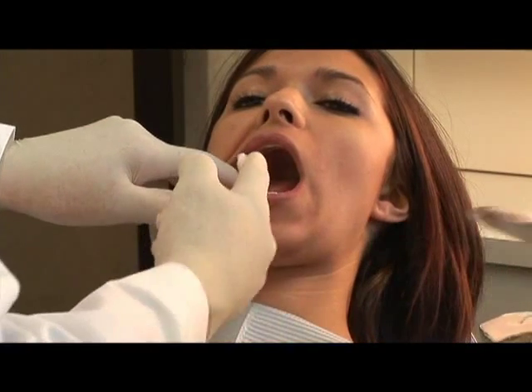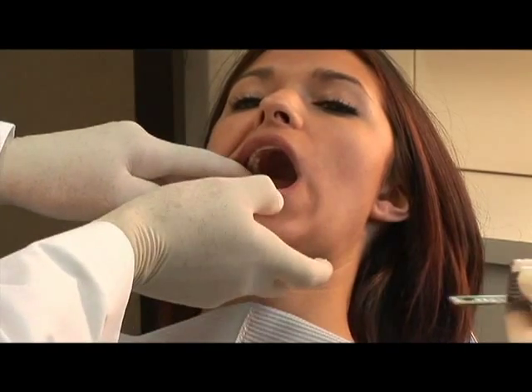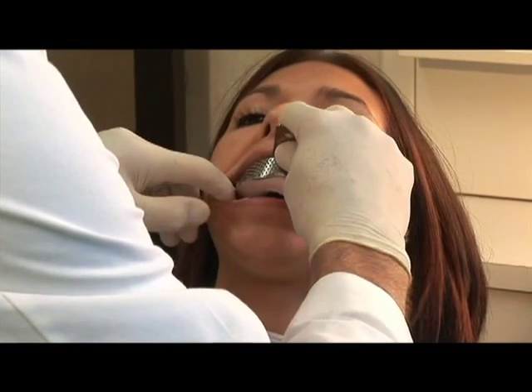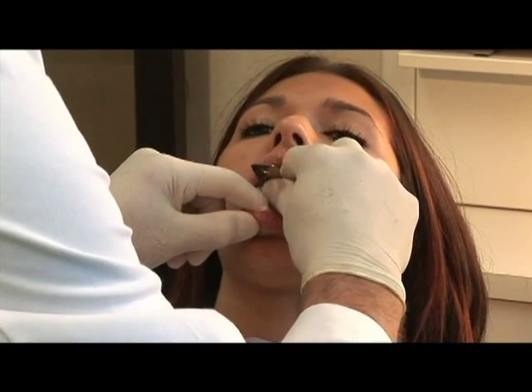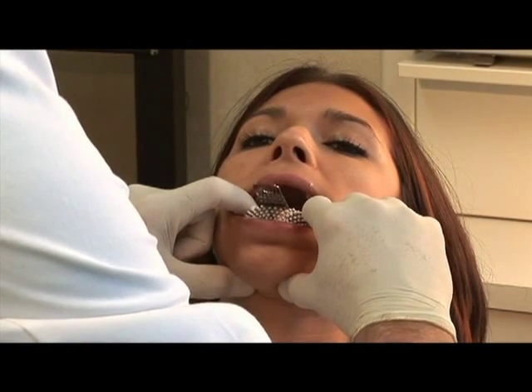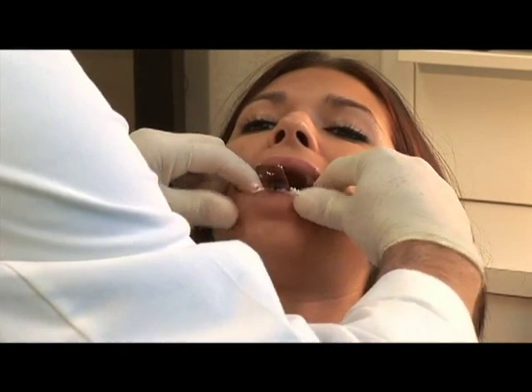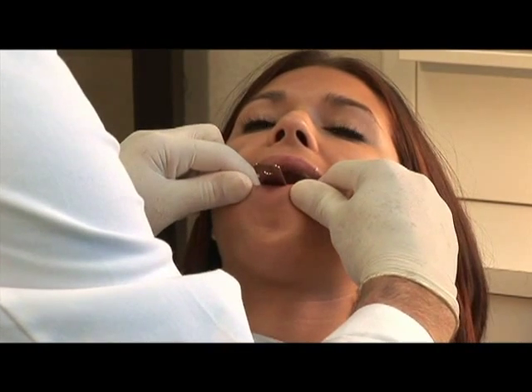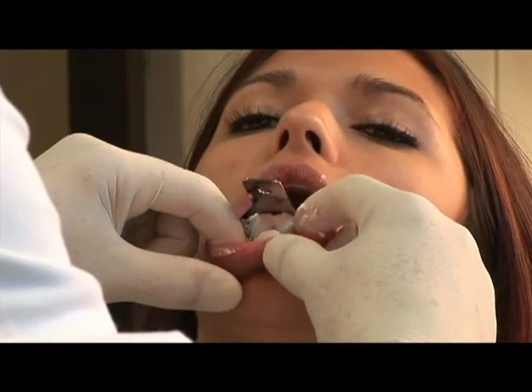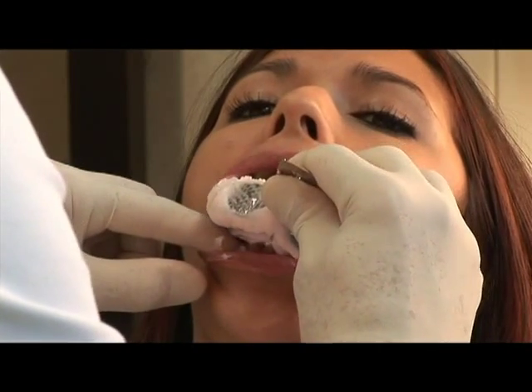First, place a small amount of impression material on your finger and rub well into the anatomy of the tooth surface. Rotate the filled impression tray onto the lower arch, then have the patient raise their tongue. Press the tray firmly on the teeth, taking care to register the impression accurately. Next, mold the facial tissue around the impression tray to help record the anatomical detail of the mouth. Once the impression material is fully set, the impression tray is removed from the mouth.